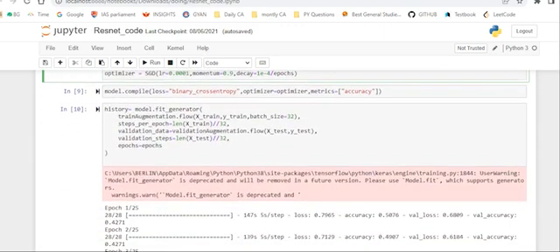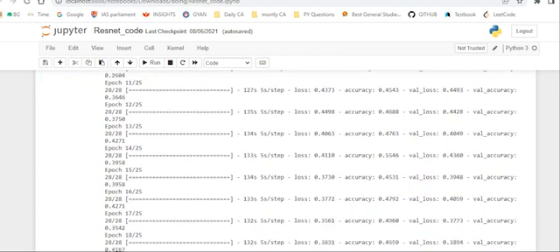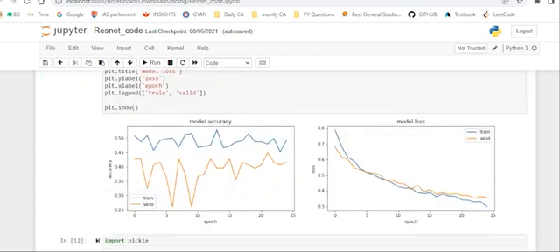One thing to be noted is that during the training and testing phase, a series of operations such as hyperparameter tuning, adjusting the epochs, having an eye on the loss rate, all are mandatory to avoid overfitting and underfitting issues. And here is the graph for model accuracy and loss rate.